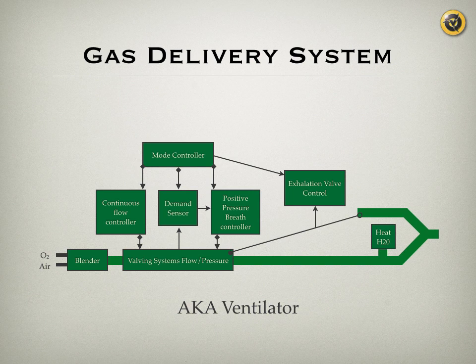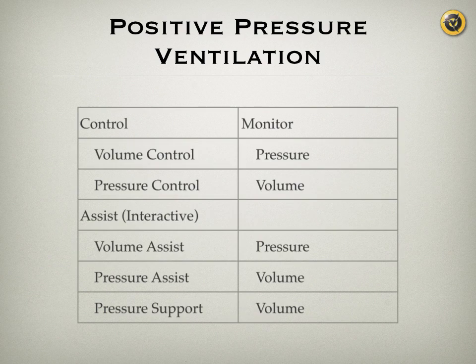So for positive pressure ventilation, we either control volume and hence we'll monitor pressures. And if we control pressure, we will monitor volumes. And for assisted or interactive modes, which also lie in both pressure or volume assist, we're going to monitor the opposite.